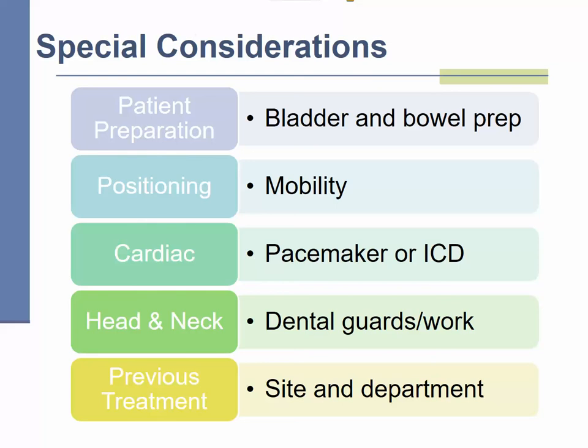An increasing number of patients who will be attending for radiation therapy do have a cardiac history where they have a pacemaker or an ICD. It's important to know that radiation treatments can alter the pacing in these devices, and we have to work closely with the pacemaker clinic to ensure treatment is being delivered in a safe manner. If you are aware that the patient has a pacemaker or ICD, please remind the RO to include this on the questionnaire as well.